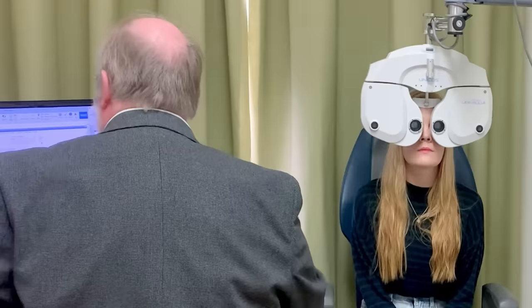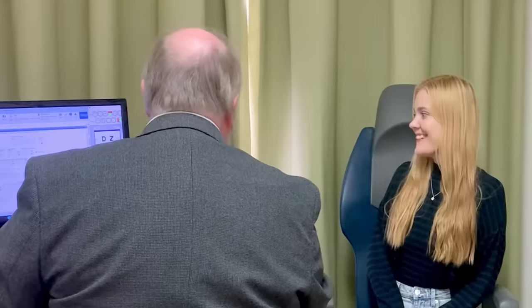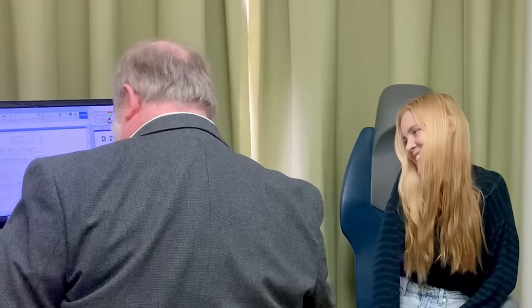Lovely. Okay, let's let you loose out of this horrible thing. Well done. Good. Well, yeah, you're definitely short-sighted. But once corrected, your vision is really, really good. Yeah, it's a lovely level. So you see at least a line better than the 100% line, so that's really good. Really sharp vision. But you do need your glasses on to do that. That's the only thing.